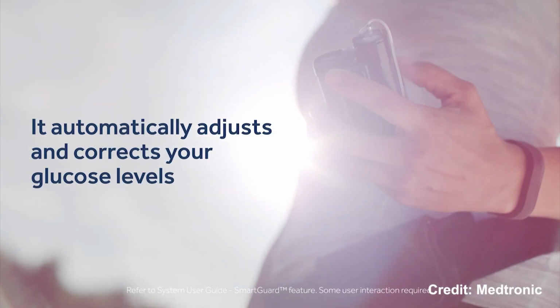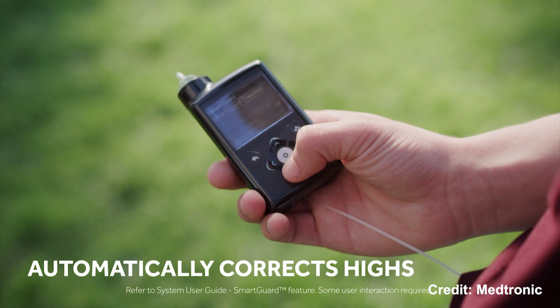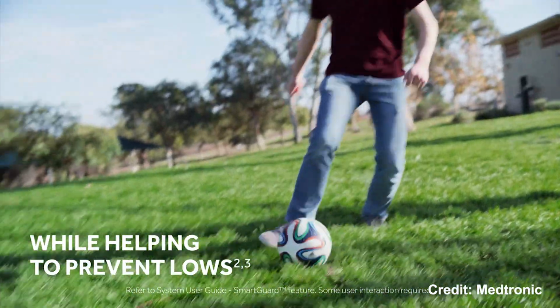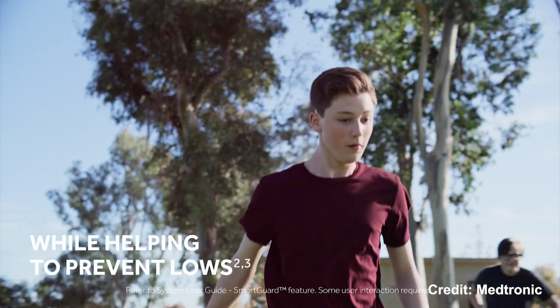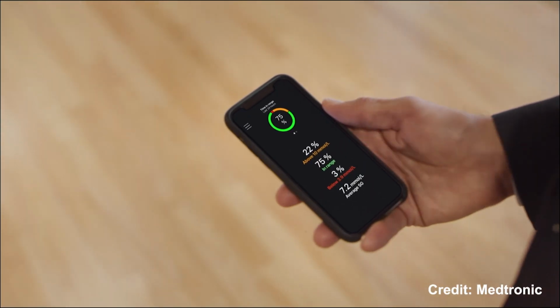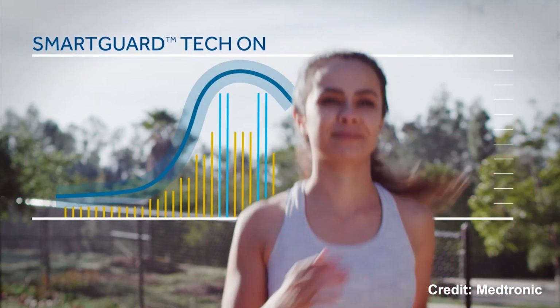Medtronic-780G. Biggest new feature compared to 670G is an automatic correction bolus to avoid highs, which is part of an improved all-new algorithm. Automatic bolus feature aims to reduce time in hyperglycemia and increase time in range. Another new feature is a customization of the glucose goal.